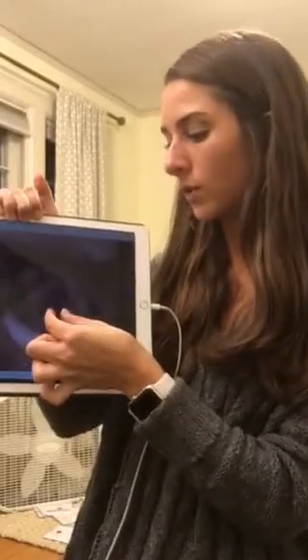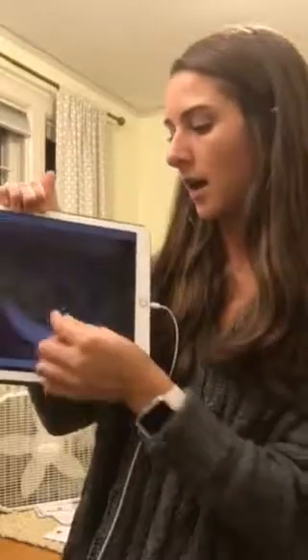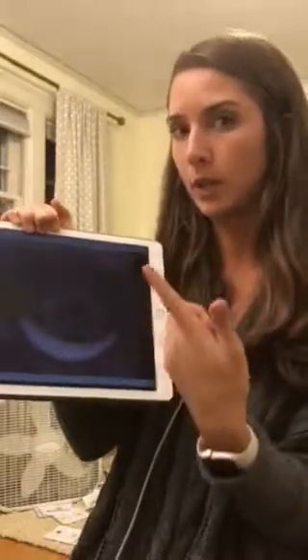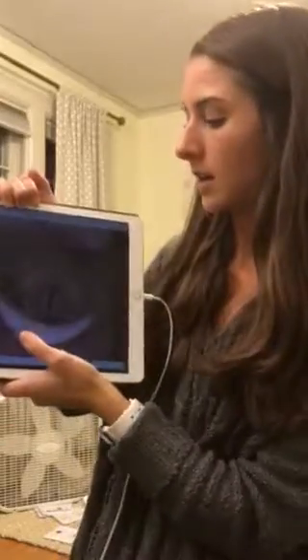Whenever your vocal folds are open and air is coming through, that just means you're breathing. When your vocal folds are really far spread apart and open, so that gap becomes way bigger, you're breathing. When your vocal folds are vibrating, then that means you're making sound. And the air is the source of that vibration, which is the source of that sound.